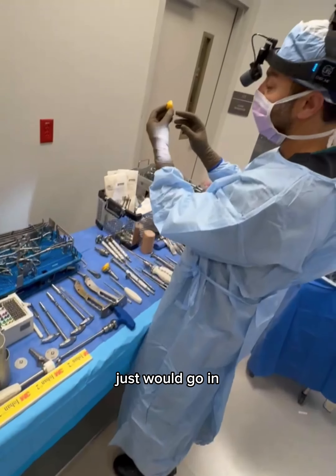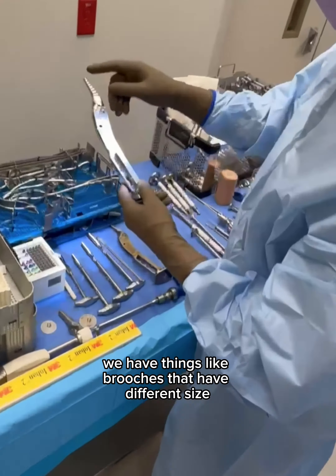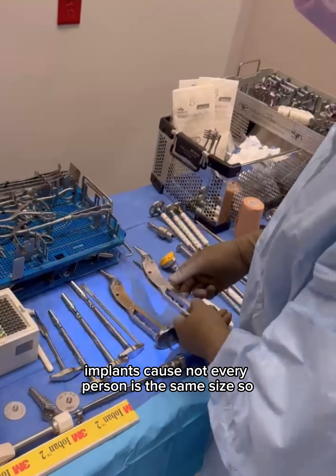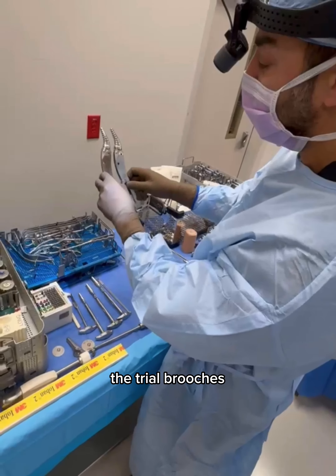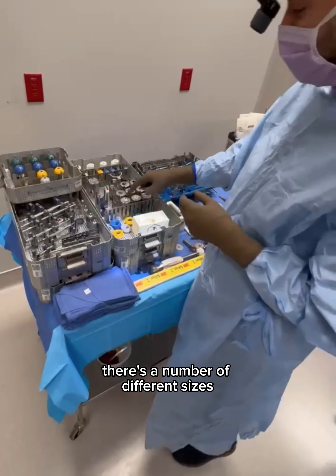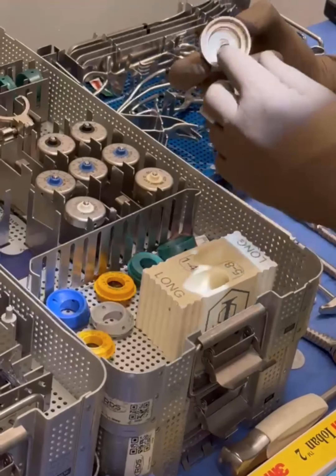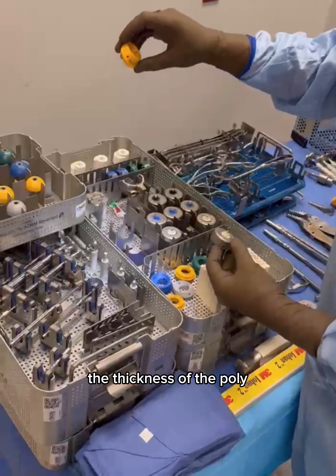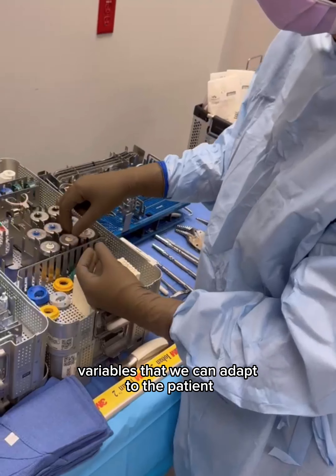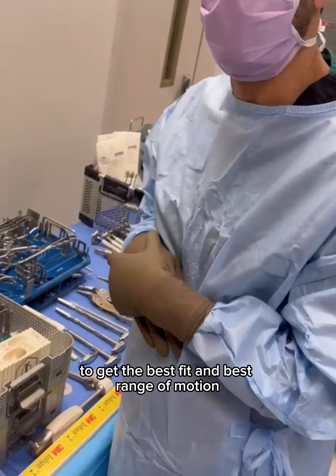When we get to the humerus side, we have things like broaches that have different size implants because not every person is the same size. You can see there are small differences in the trial broaches. And then if we come over here, there are a number of different sizes — things like the diameter, the thickness of the poly. So it has a lot of different variables that we can adapt to the patient to get the best fit and the best range of motion.